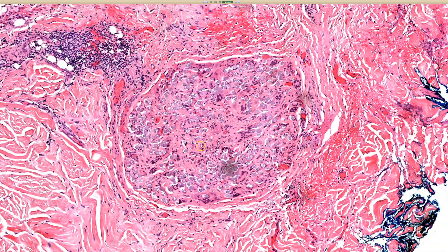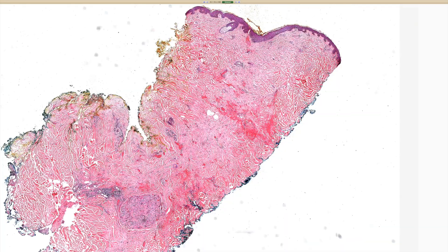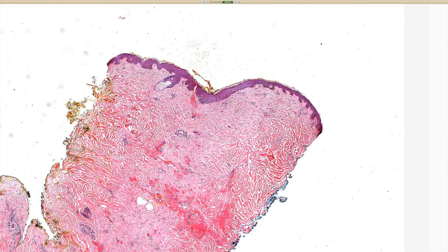Always a nice one to show to the junior trainees, and they give appropriate oohs and ahs when you do that. So that's a suture granuloma. And sometimes sutures can perforate out — if they're close to the top, they can perforate out through the epidermis. And another clue for a suture here is, look, we've got a scar right there.